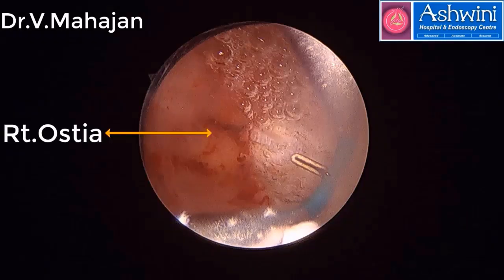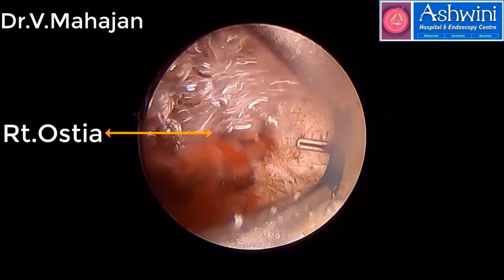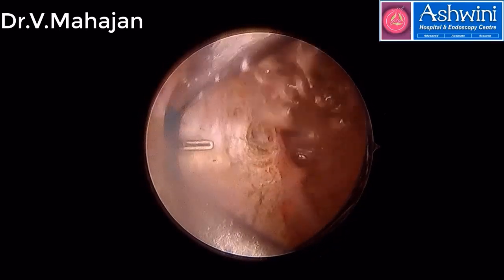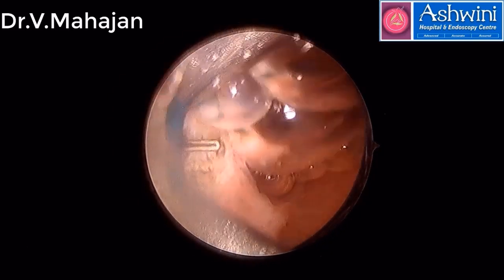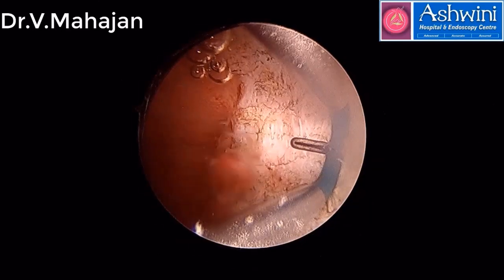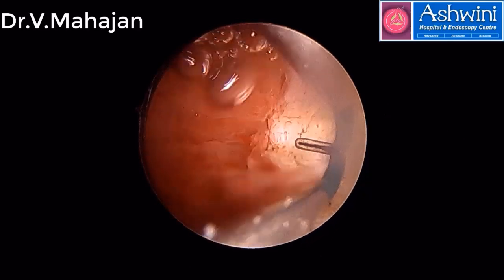This is the right ostium. I always keep my eyes on the ostia. I retract my telescope, I see the ostia and then go on cutting. Usually in a septum surgery, we post for a relook hysteroscopy 6 weeks after the primary surgery. Here we are just touching the septum and pressing the pedal. Normal saline is used as a distension media. The pressure, we start with 80 mm of mercury, and if need arises, we can go up to 100 mm of mercury.